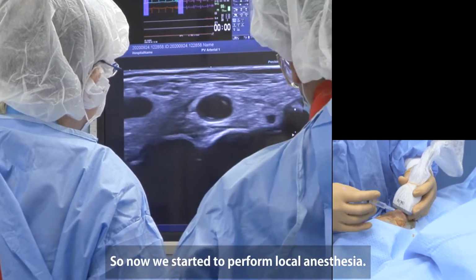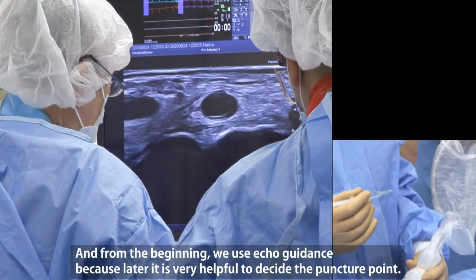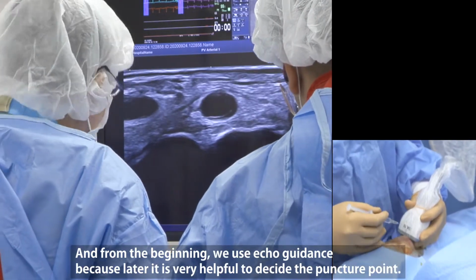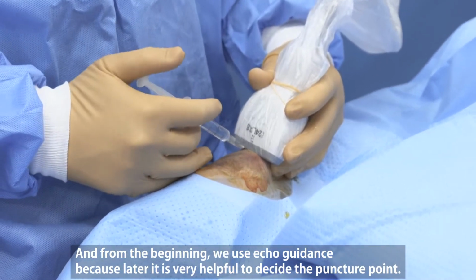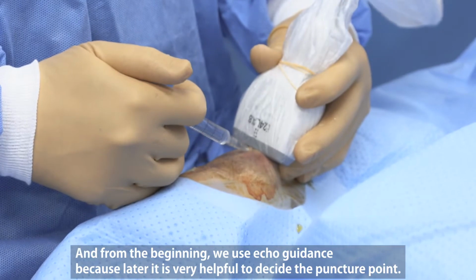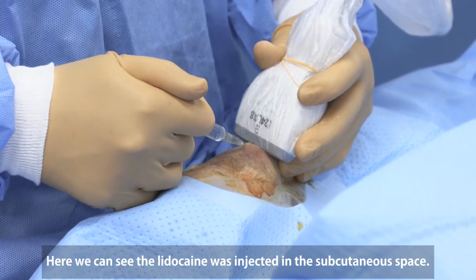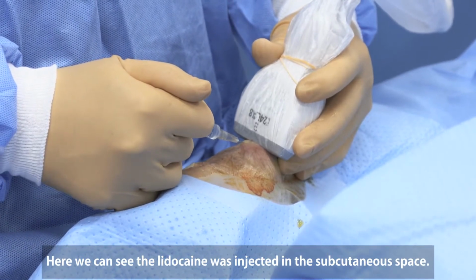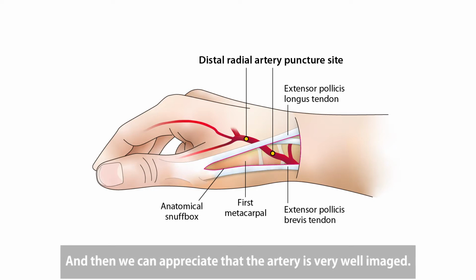So now we started performing local anesthesia, and from the beginning we use the echo guide because later it is very helpful to decide the puncture point. Here you can see the lidocaine was injected in the subcutaneous space. And then you can appreciate the artery is very well imaged.